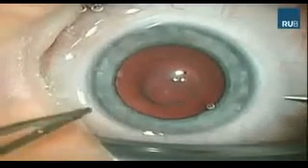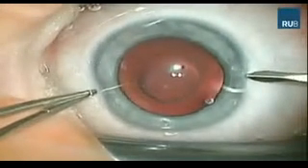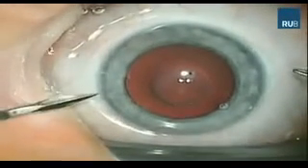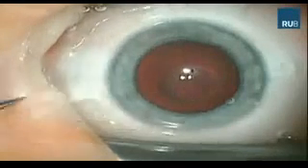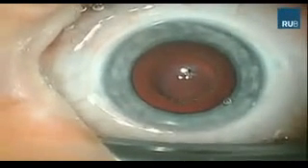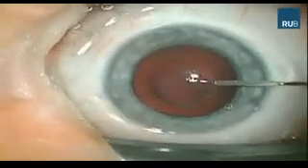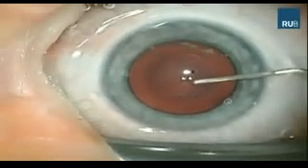After undocking from the laser, 2 paracenteses are made at 9 and 3 o'clock using the Blumenthal knife. A perfect capsulotomy can be seen. Notice the free-floating capsule disc is resting in a slightly temporal and superior position. After filling the AC with OVD, the free-floating capsulotomy is taken out with a microforceps for further histopathological and dimensional evaluations.